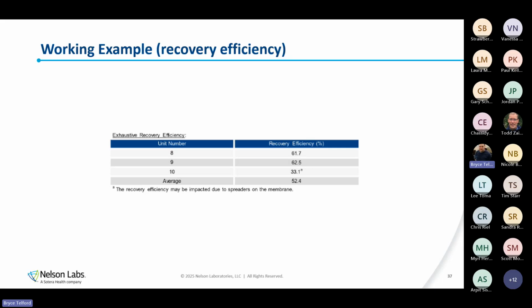We might have switched from one supplier to another. It might be the same material, but let's say the new supplier uses a different release agent. That release agent, for all we know, may be inhibitory. That can affect the overall product inhibition. So kind of a similar situation when it comes to the method suitability and inhibition.